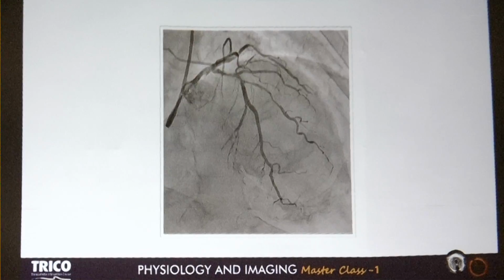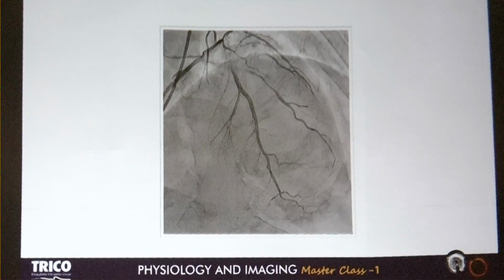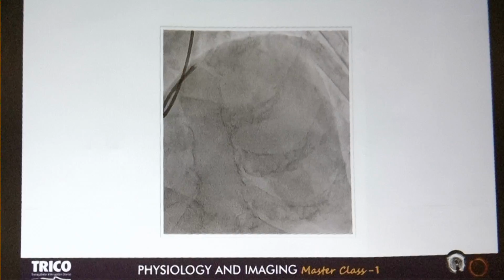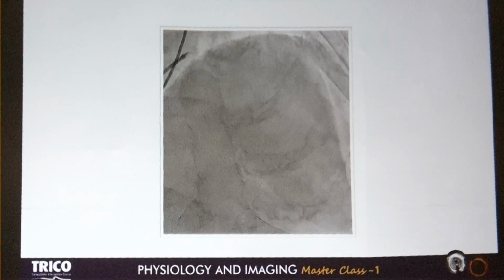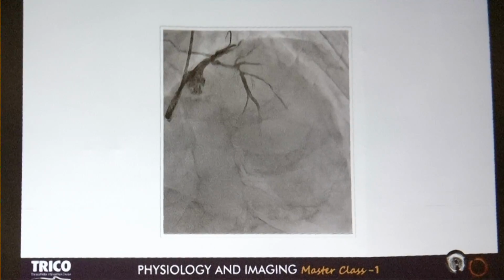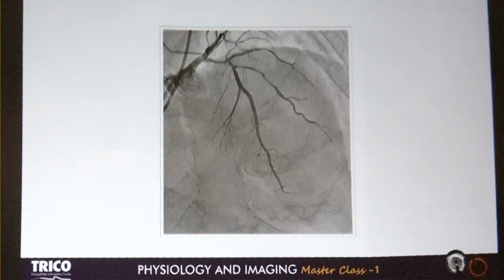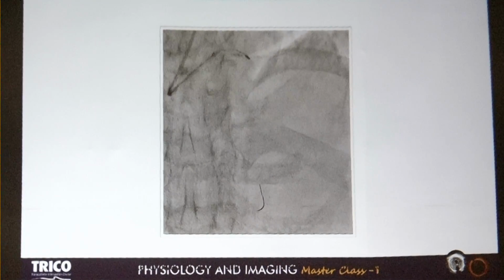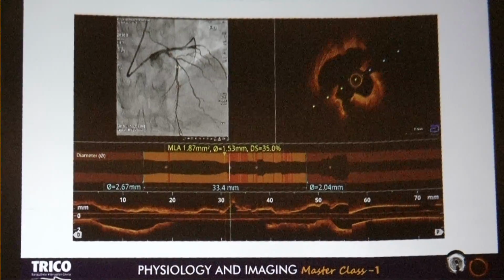It started like this, and I was told that it's a calcified artery. We want a rotablator demonstration from you. We have OCT IVUS. I asked for lithotripsy. Lithotripsy was not available. And in the live demonstration program, here I made a blunder which I want to admit, a very interesting blunder. Ultimately the patient outcome was good, so I am happy. Rotablator was done. And then I evaluated with OCT.